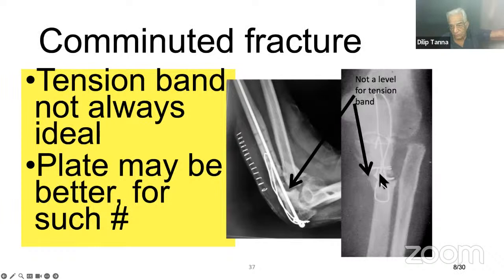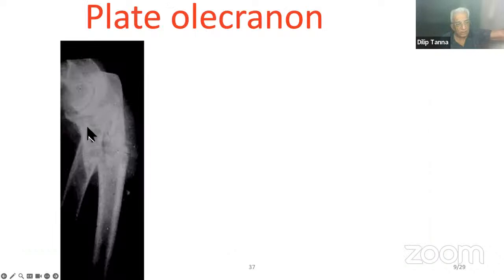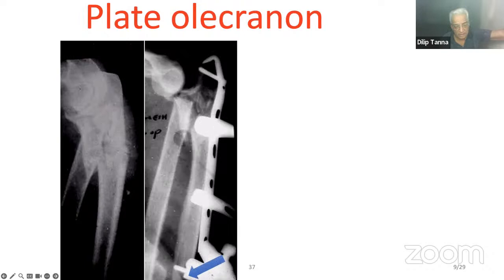Now this is the plate of the olecranon. These are the fractures which need plating. So as you can see, this is the hook plate. Then I'm doing the tensioning here. This is the Muller device.